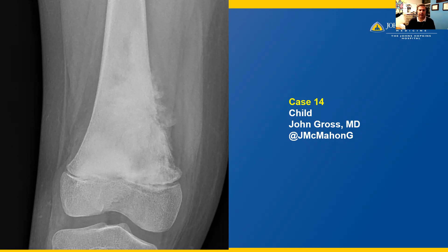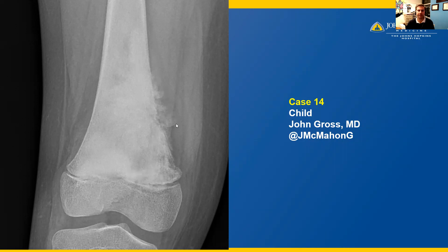Plain film radiographs show an aggressive appearing radio density in the metaphysis in the distal femur, shown here with this very white radio density, both intramedullary as well as breaking through the cortex and lifting the periosteum here as a so-called Codman's triangle. This is a very aggressive pattern and concerning for an osteosarcoma.